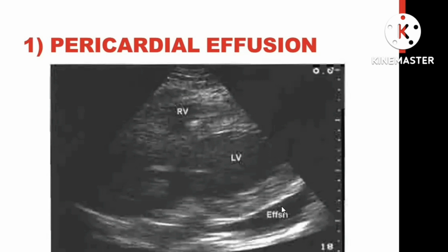Sometimes, yes. No, this is not the pericardium. It looks like pericardium, right? Where is the descending aorta? Yellow. It looks like a pericardium, huh? I think it's the muscle that looks thick, because you don't see the descending aorta here. It's more anterior to the descending aorta.